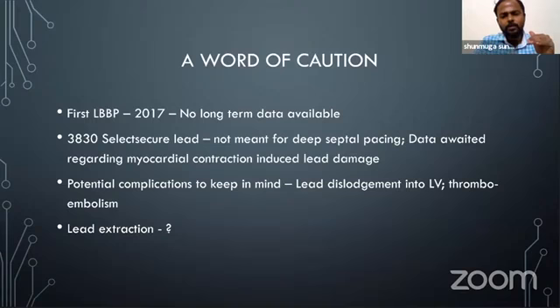So the word of caution: we know that LBBP is a recently evolved technique. The first procedure was done in 2017 by Dr. Wang of China, and from there the therapy has evolved. Now centers in the US, Europe, and India are extensively doing left bundle branch pacing. But the problem is it's a recent technique, and there is no long-term safety data available.